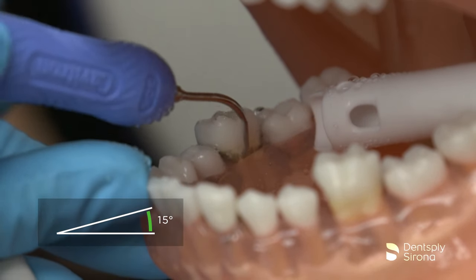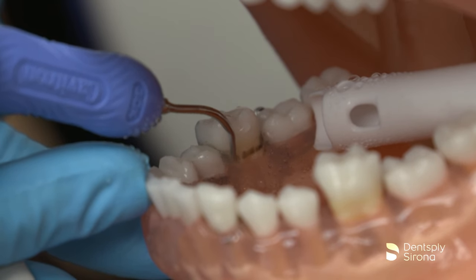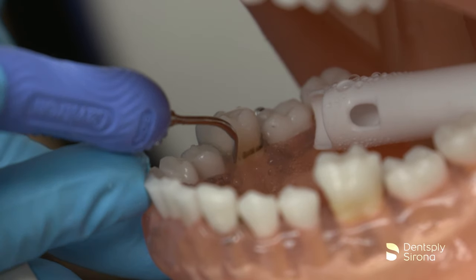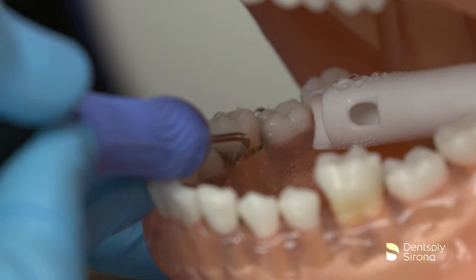The clinician continues scaling and demonstrates strokes in the horizontal, transverse, and vertical orientation to fracture and remove deposits. Utilizing an overlapping methodical stroke pattern is essential to achieve thorough removal of biofilm and calculus.